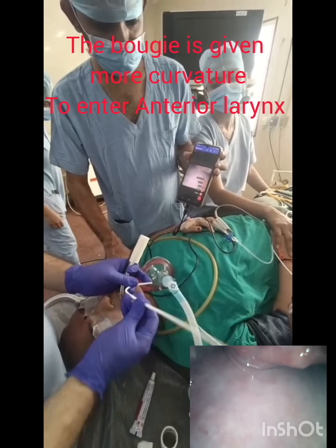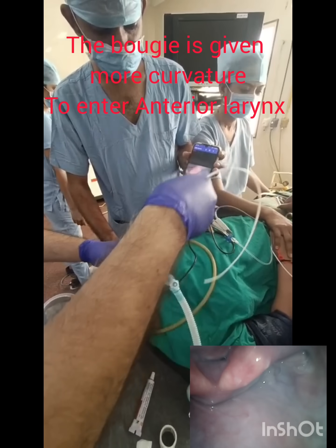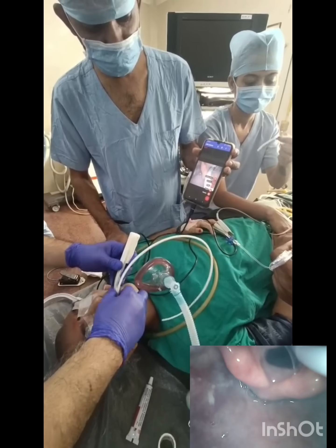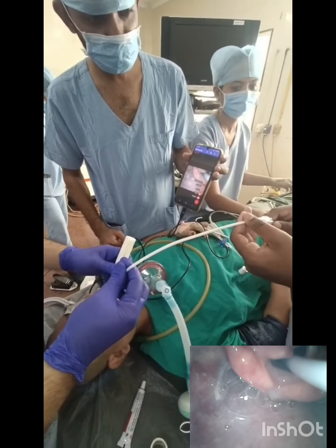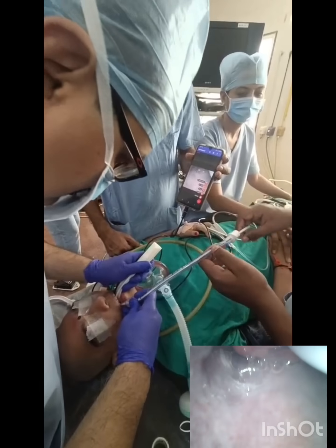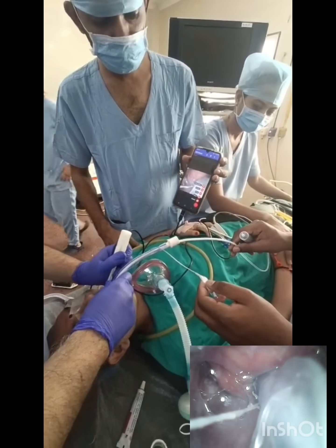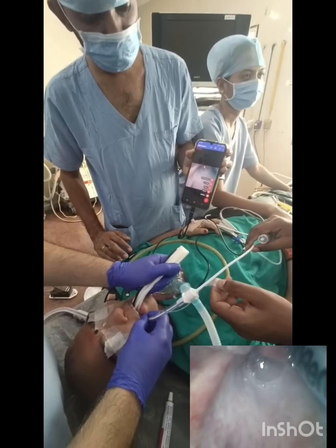I have to shape the bougie in order to intubate this patient. The bougie has entered into the larynx. Now inserting the 7mm tube — I hope it will go through. Yes, the 7mm tube has entered into the larynx. Intubation is done.